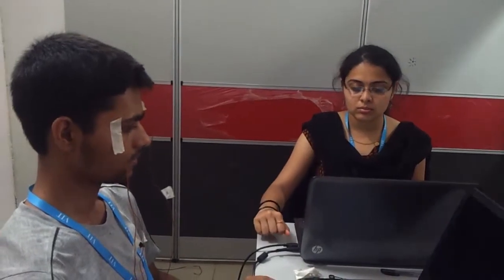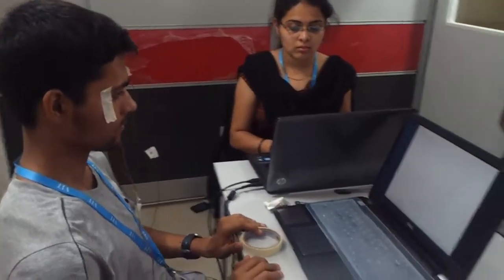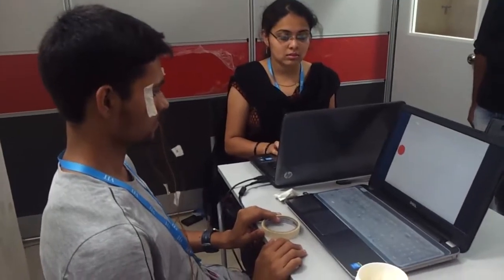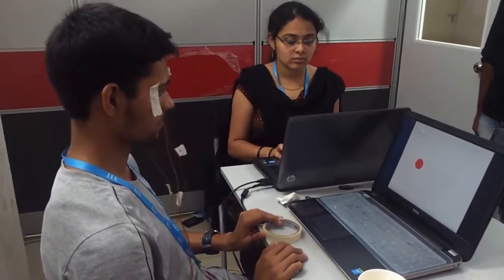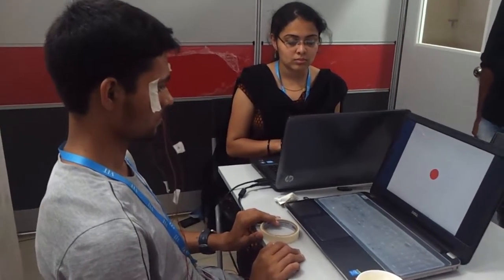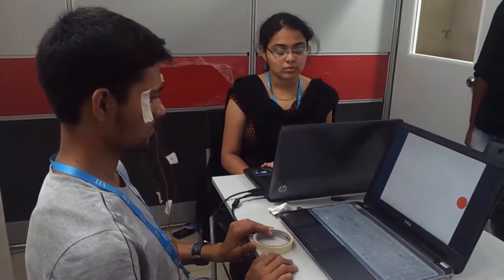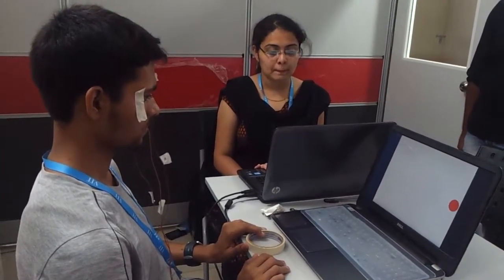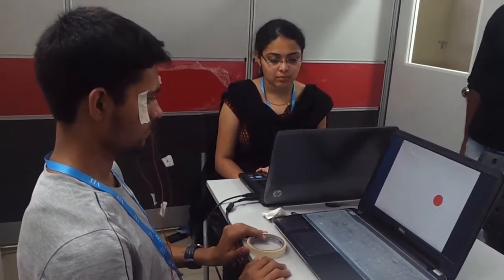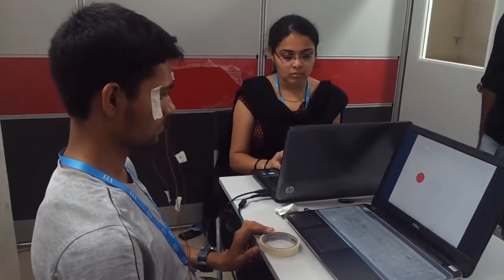Here, the person views the visual stimulus when I tap. As you can see, as I tap, the PowerPoint presentation starts, where the person has to track the red ball using his eyes. At the same time, I use LabVIEW Signal Express to record the values as he tracks the red ball.